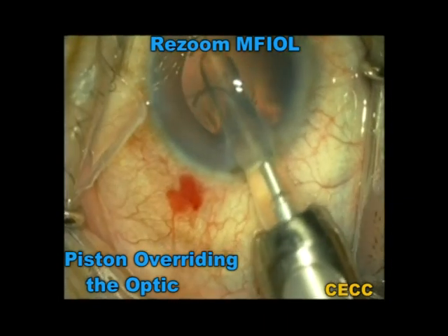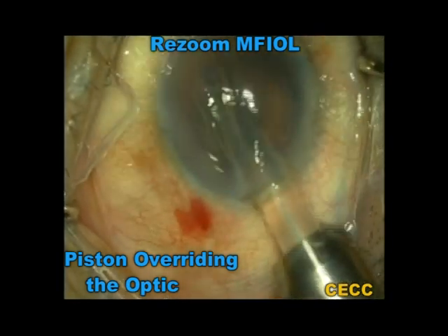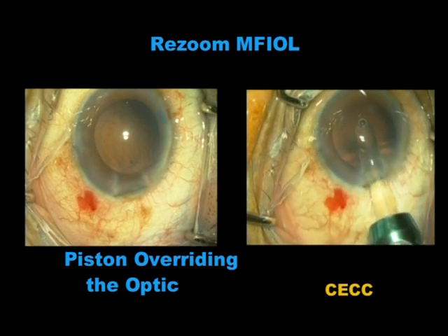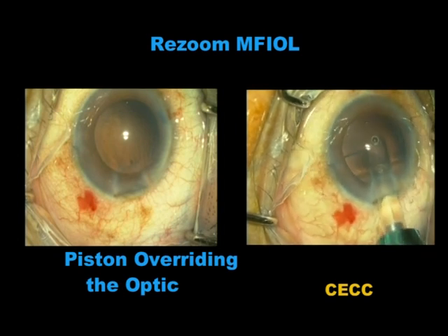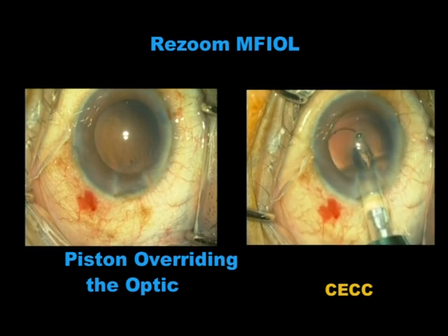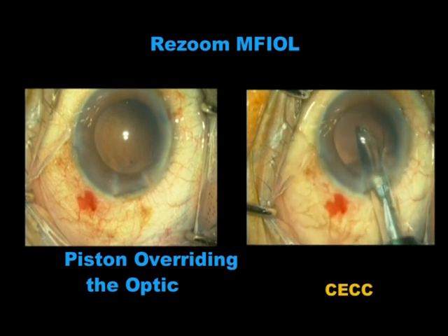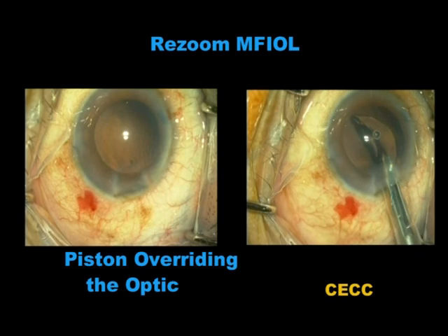We decided not to release the intraocular lens from the cartridge and withdrew the insertion system from the eye. We loaded a fresh IOL in a different injector system, as you see in the video to the right. You can see the implantation going on very smoothly. The plunger is clearly seen to push the trailing optic edge without overriding the optic surface.